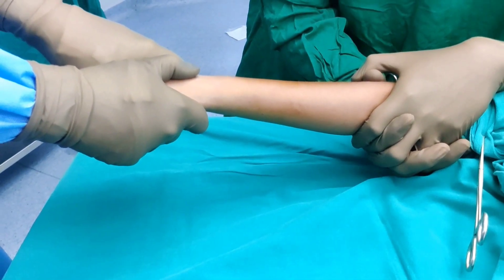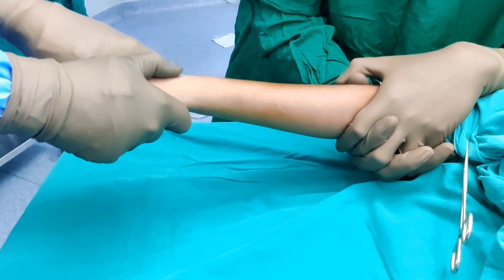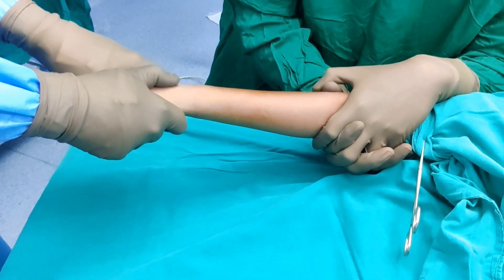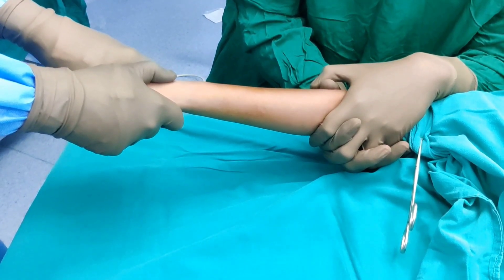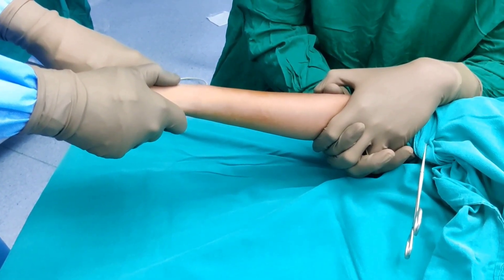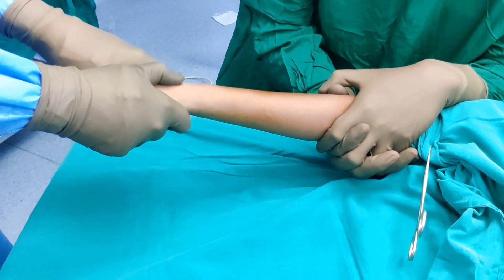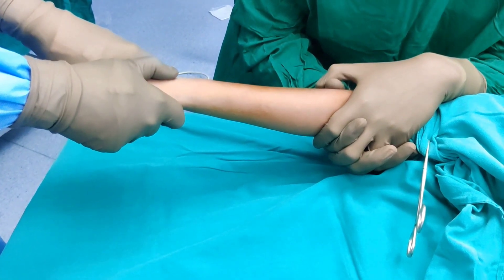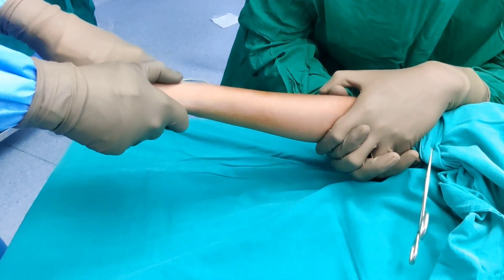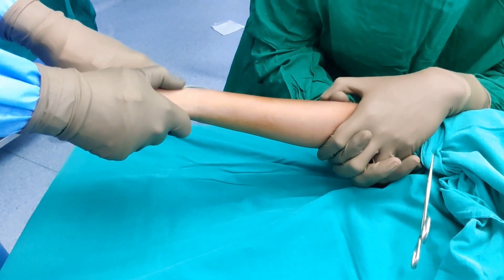I have already uploaded a video on how to pass a K wire for a Salter injury in pediatrics and the principle will be the same, so please watch that for detail. The question here is whether to go through the physis or avoid the physis. If you are good at it and can get it at one go, I do not think there is any harm in going through the physis. However, if you are learning and think you may need more than one attempt, try to avoid the physis — stay slightly proximal and pass the wire away from the physis.